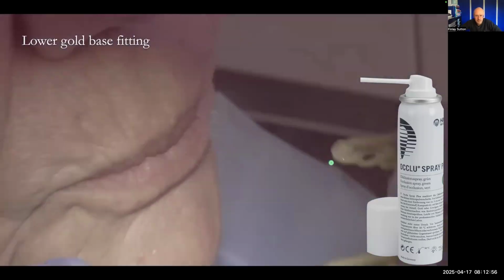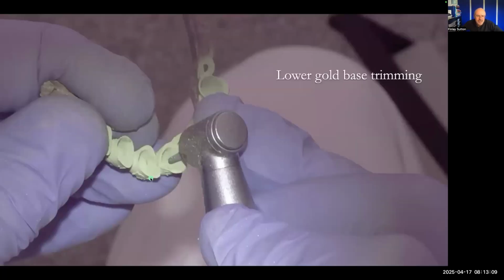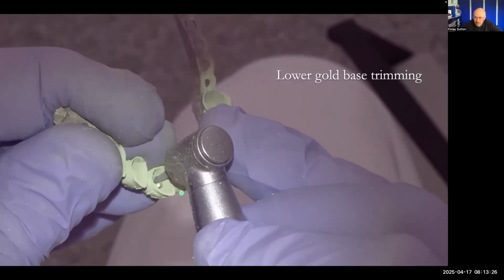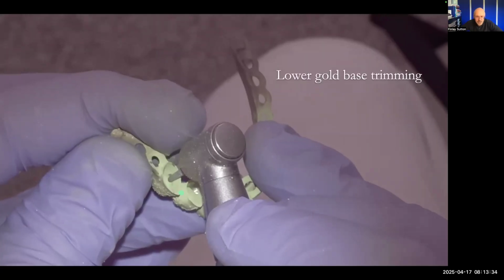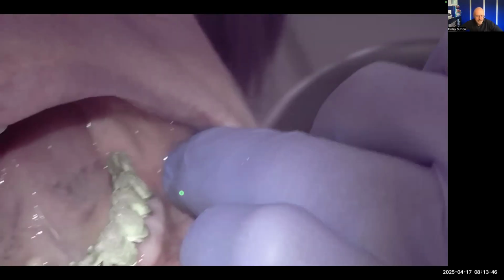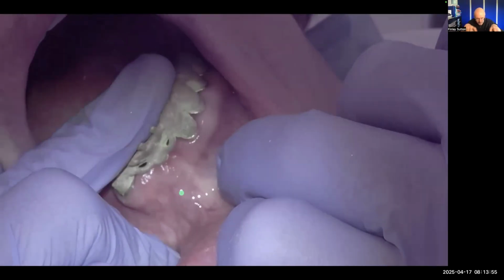Take it to the mouth. Push it down and then give it a wiggle, just really get it pushing, and then take it out. And then where I can see it just holding off, I use my speed increasing handpiece there just to drill on those parts that I can see have rubbed off. So I just do that on those areas. It took me ages to get it fitting really passively. It probably took me about 20 to 30 minutes to do this, just step by step, really carefully, popping it back in and adjusting it until I was happy that it was sitting passively without moving any of those teeth.